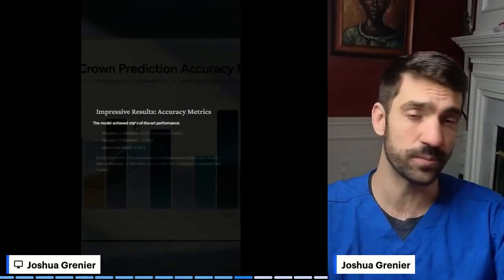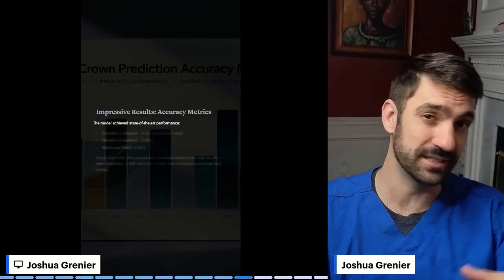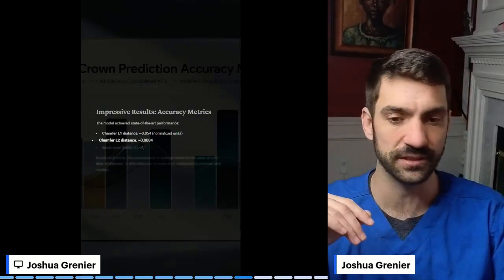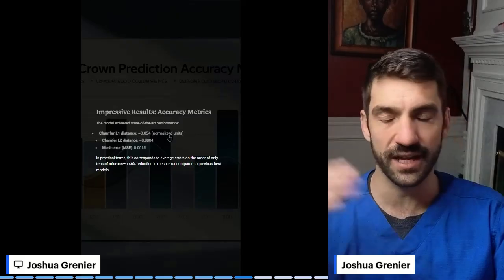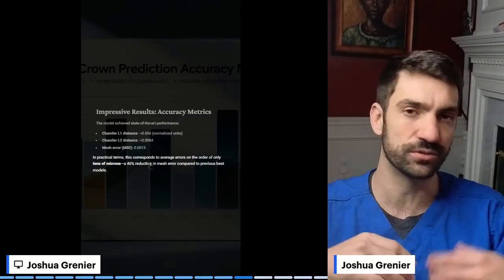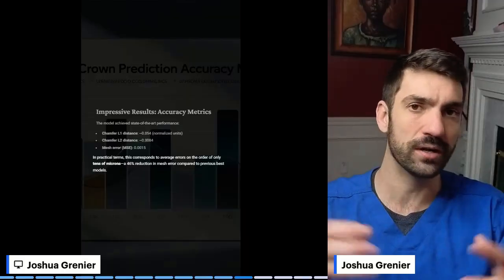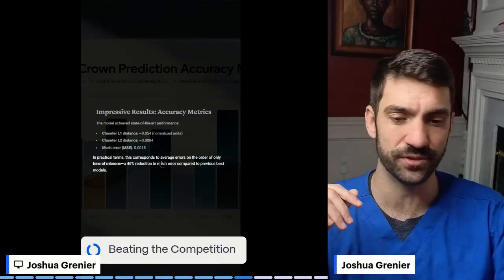And this approach, this essentially off-the-shelf, open source approach, which many things in AI are, worked. DeepSeek, for example, used open source components to actually build it. It was incredibly accurate. It had a very low mean squared error. The Manhattan distance was a little different than the Euclidean, as expected, but incredibly close to the source of truth. But almost, in my mind, this is too close, because natural teeth have even more variation than what we're seeing here. So what this tells me is it could have memorized the data to a degree.